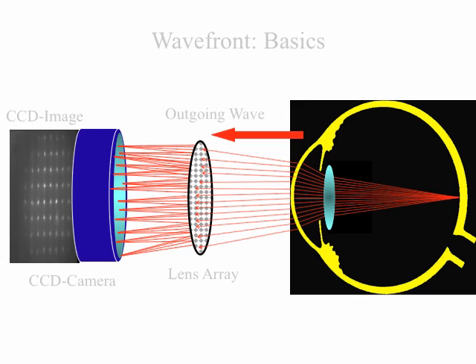If the rays of light striking that disc are perfectly parallel, then if we put, let's say, a little piece of black paper on the side of our disc with the apertures, on the opposite side from the eye, then we'll produce tiny pinpoints of light on this sheet of black paper as the photons pass through this disc with a 1 millimeter spaced grid of holes. And what will the pattern be on that black sheet of paper? Well, not only will it be regularly spaced little white dots, but in fact that spacing will remain 1 millimeter separated. We're going to produce a grid that's identical not only in pattern, but in actual spacing, in actual measurement, to the pattern of apertures on the disc.